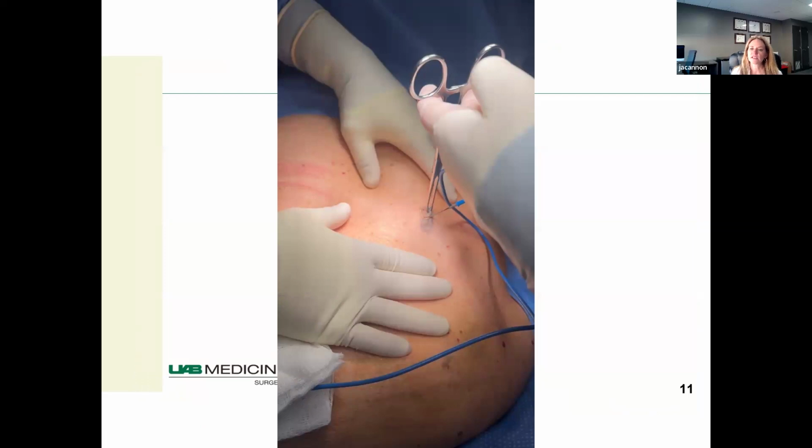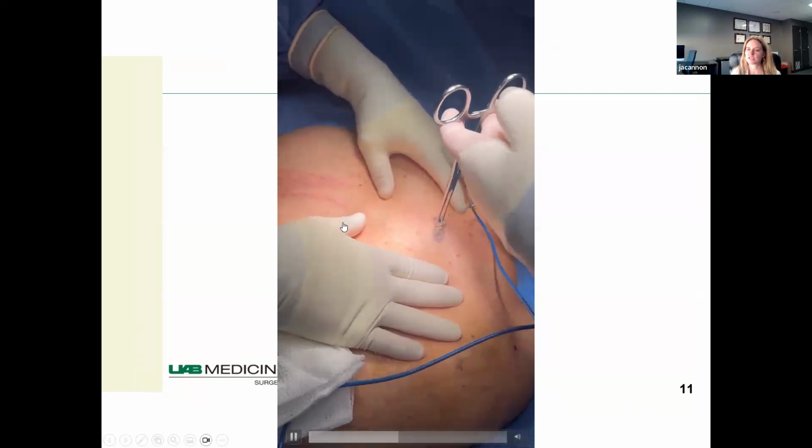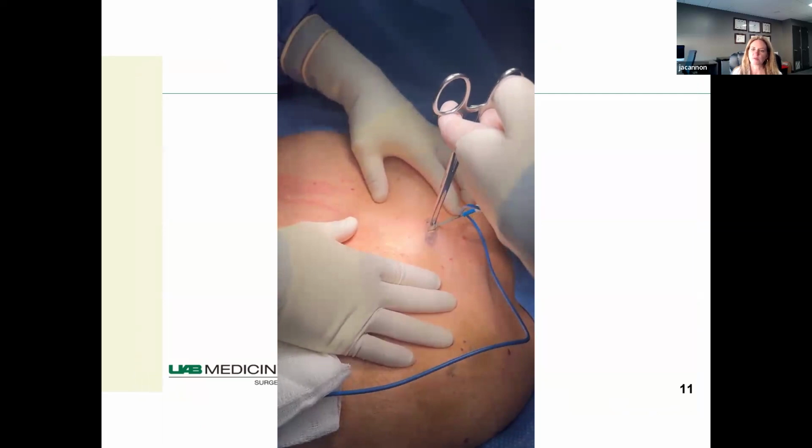Because they're all going to get a colostomy, I'll generally start these operations with a cut down. So we'll start where they've been marked for their colostomy and just incise the skin, place our 12mm robotic trocar in through that site, get our pneumoperitoneum, and then choose where our other 8mm trocars are going to be.